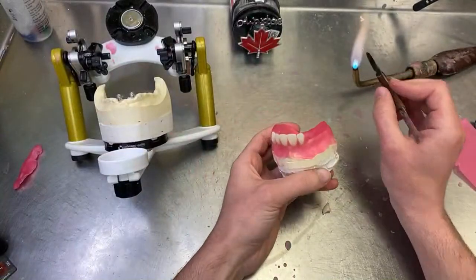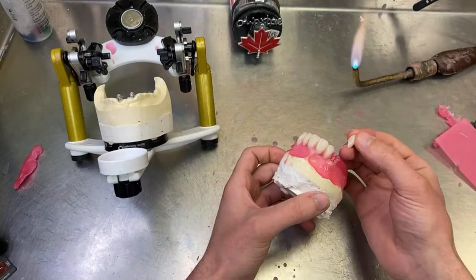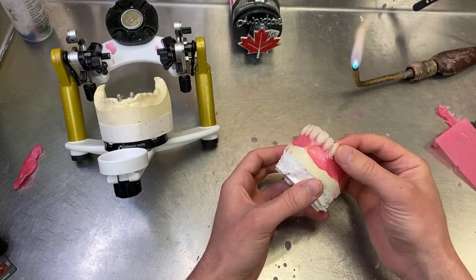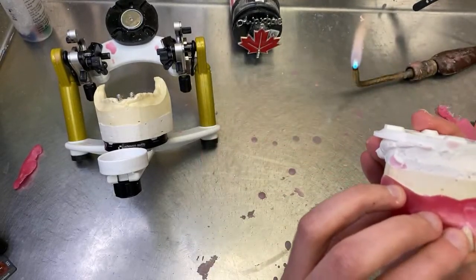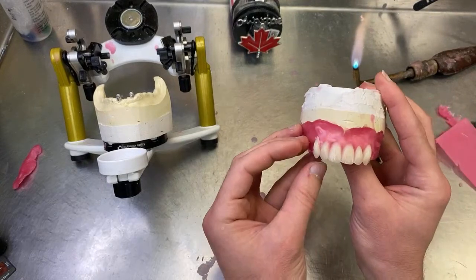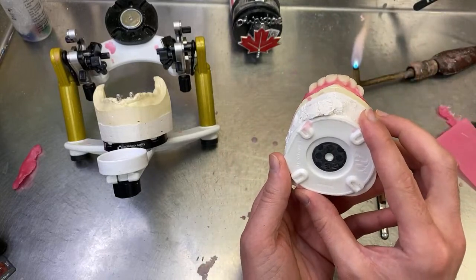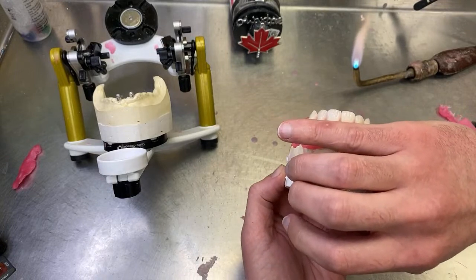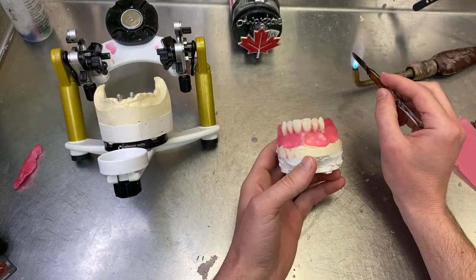I always like to check the work on the articulator, so I take it on and off 10,000 times a day. See, this is a little too much, so that will look bad. Make sure they look the same. You look at it that way as well. The same. If it looks good upside down, guarantee it will look good when it's in the right way.